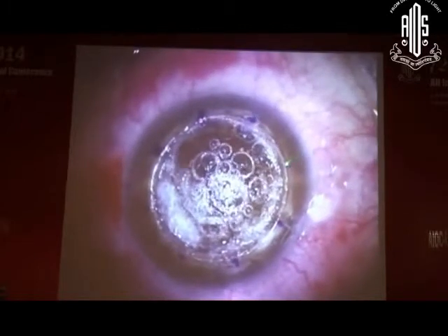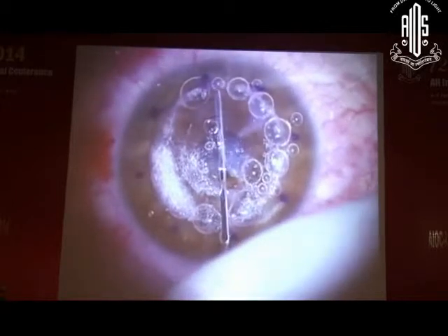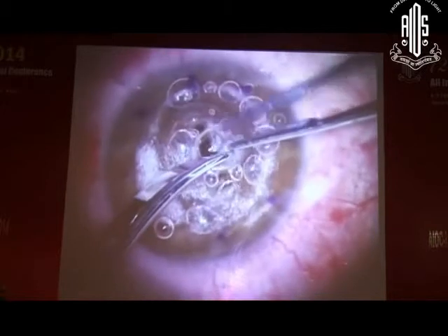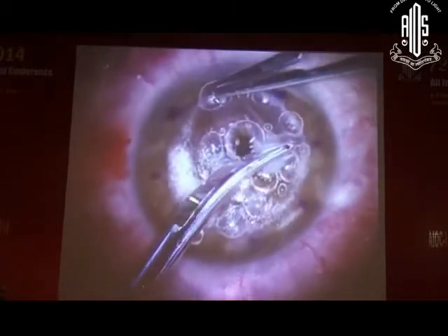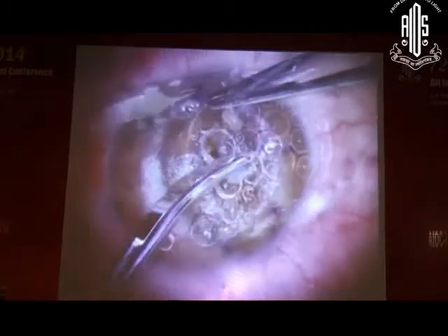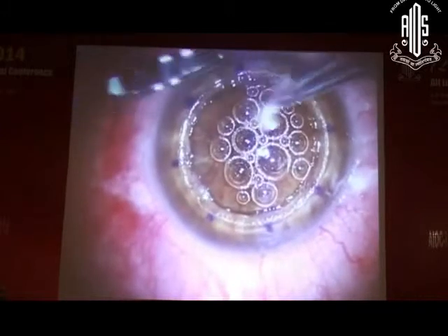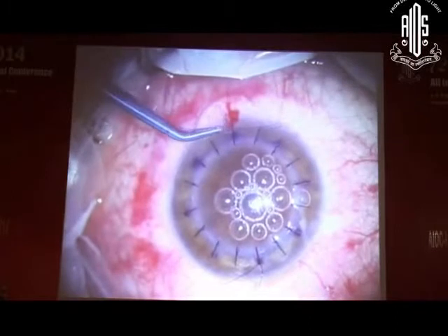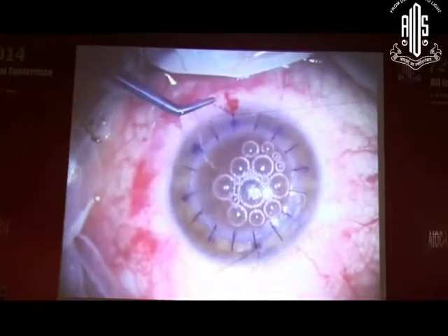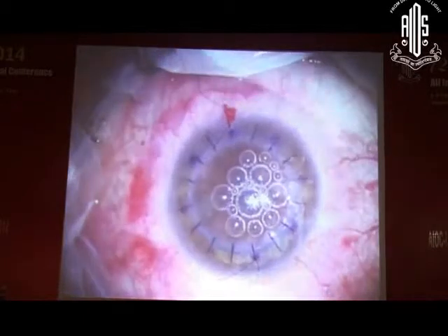You'll see that I've reinforced these marks with ink because they do tend to fade. But the eye bank is cutting the donor. I'm the one who cuts the recipient. And the donor cornea also has these alignment marks. So you can ensure perfect distribution of the tissue when using the femtosecond laser, either for a DALK or penetrating keratoplasty. Also, there's this posterior side cut that's at an angle. It's a 30-degree angle, so I don't have to hold my scissors perpendicular to the Descemet's in order to cut. I can cut along that angle, which for me makes it a little bit safer.